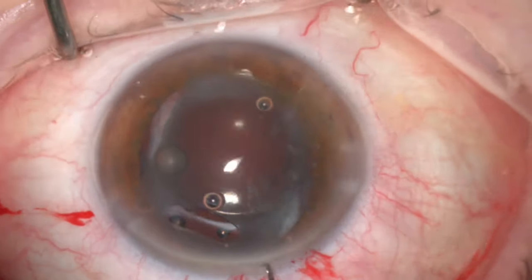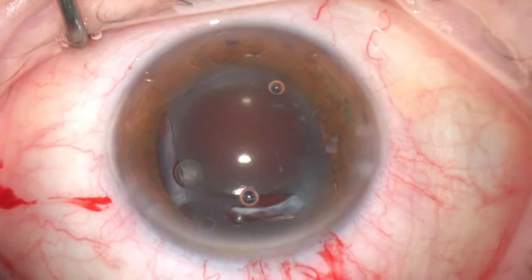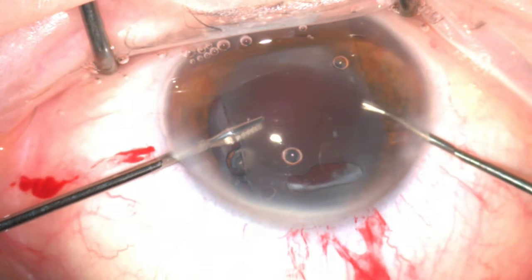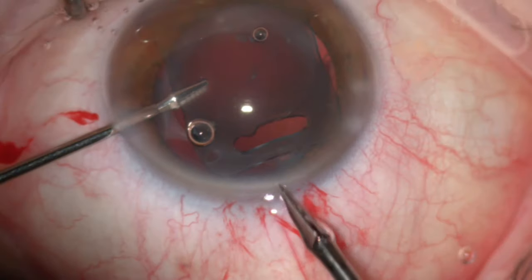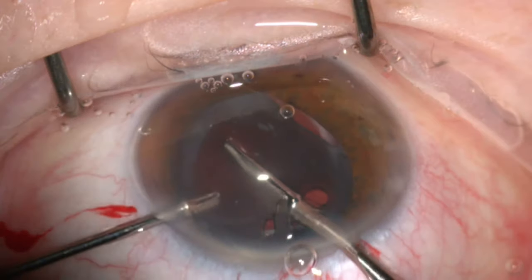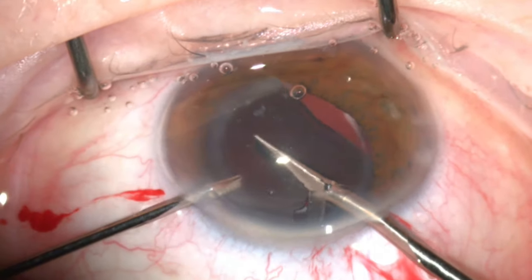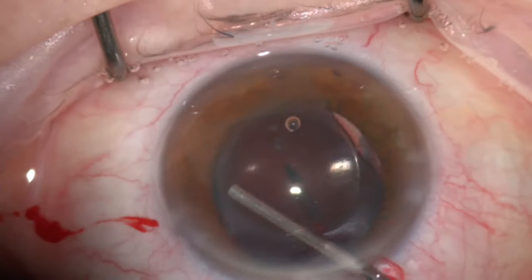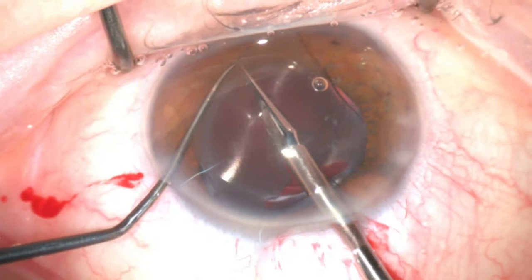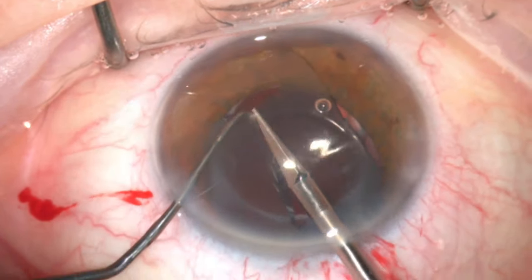I slightly rotated the lens along the axis of the main incision to allow for easier cutting and explantation. I prefer to cut it into two halves before explantation. A 23-gauge serrated forceps was used to hold the lens from the side port and lens-cutting scissors were used to cut the lens, dividing it into two halves. I cut with the scissors as far as I can go — it can be tricky with plate haptic lens implants compared to other lens designs. Further visco-elastic was injected to deepen the anterior chamber and protect the cornea. Then a Sinski hook was used to provide some counter-traction and complete the cutting of the lens into two separate halves.